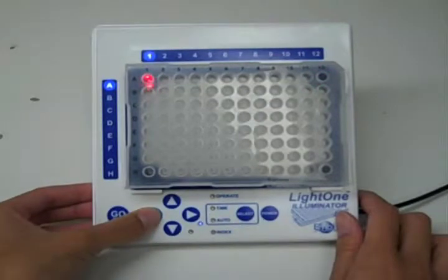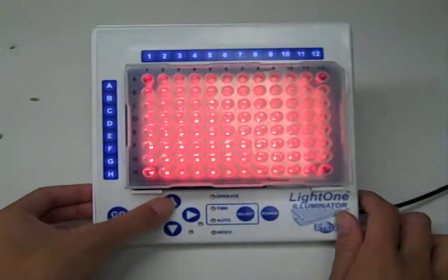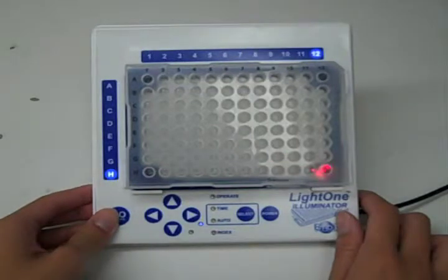To illuminate the entire field, just press left once and up once. To get to the last well, press up and left again, and you're at H12.